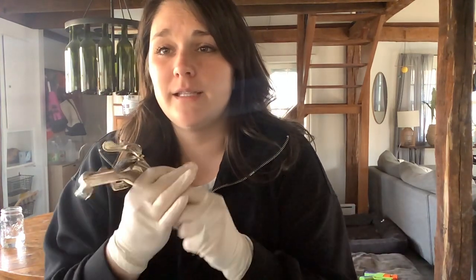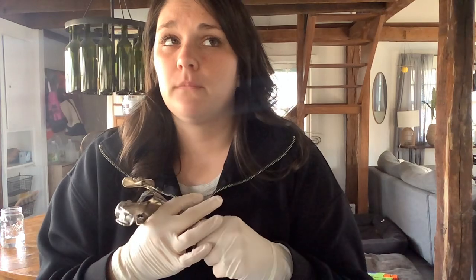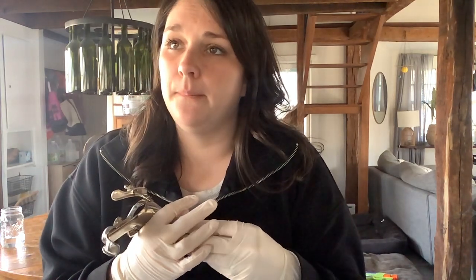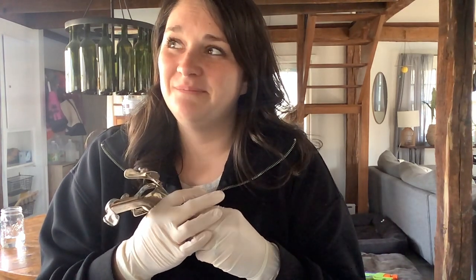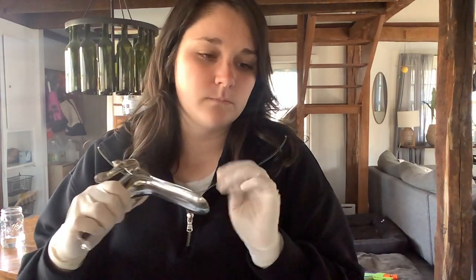For the speculum, you want to make sure that it's warmed if possible. You also want to make sure that you do have a lubricant. There's been research that suggests no lubricant because it can mess with the exam. But there isn't a lot of evidence out there that supports this. So I would want to make sure that there's lubricant on this for them.